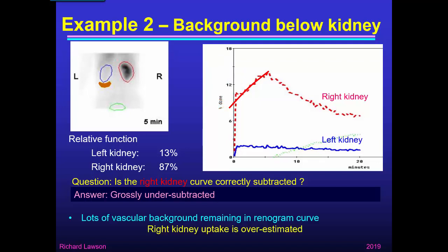There's still lots of blood background remaining in the right renogram curve, because we've only subtracted a little bit of tissue and there's still a lot of blood background there. Remember, this is DTPA, which has less activity in the kidney and much more in the blood. So in this case, we've certainly overestimated the uptake in the right kidney.